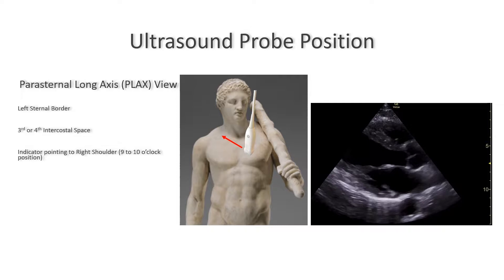In the parasternal long axis view, you should be able to see the ventricle nice and full. You should not see the apex and you should not foreshorten the ventricle. If you do, you may have to rotate, tilt or rock the probe to maximize the left ventricle cavity. Also note that by convention, the indicator of the probe correlates to the right side of the image. This can be changed in the settings of the machine, so make sure that you see the mark on the image — some manufacturers will put their logo and some others will just put a dot.